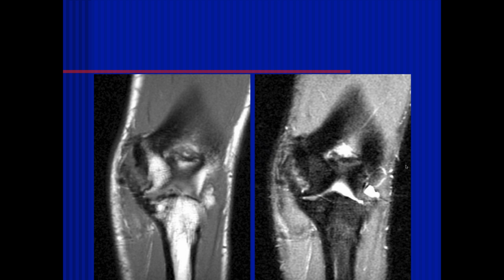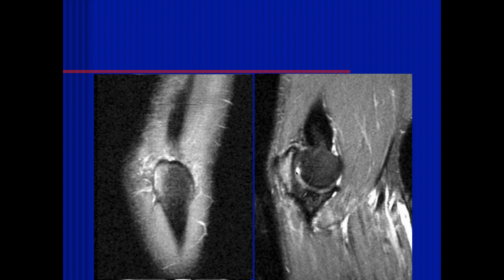And then here we can see a lot of irregularity, thickening, some metal artifact along what looks like a graft here. That's probably a tunnel in the sublime tubercle there. Here we see a lot of increased signal intensity and thickening of the soft tissues adjacent to the medial epicondyle.